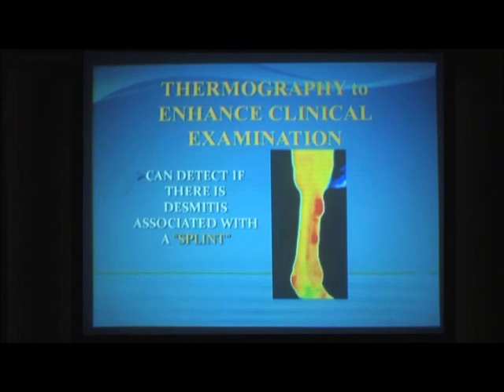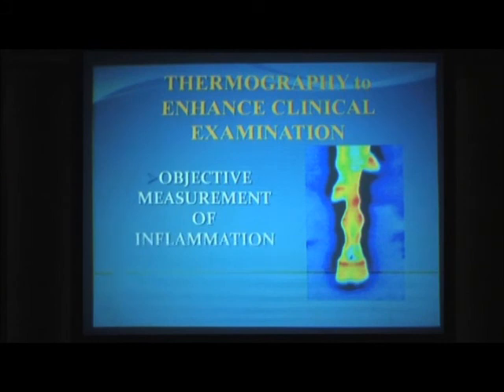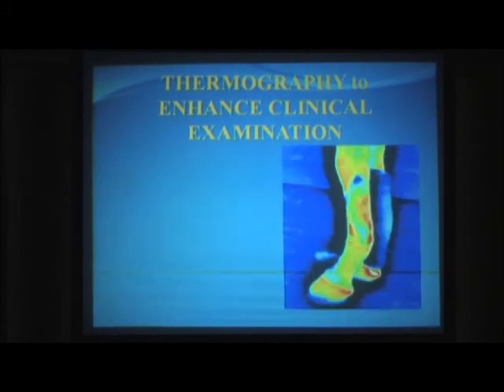Associated splint. If there's some desmitis associated with a splint, there's a suspensory desmitis. So it confirms it with the thermography. Objective measurement of inflammation. Okay, there.